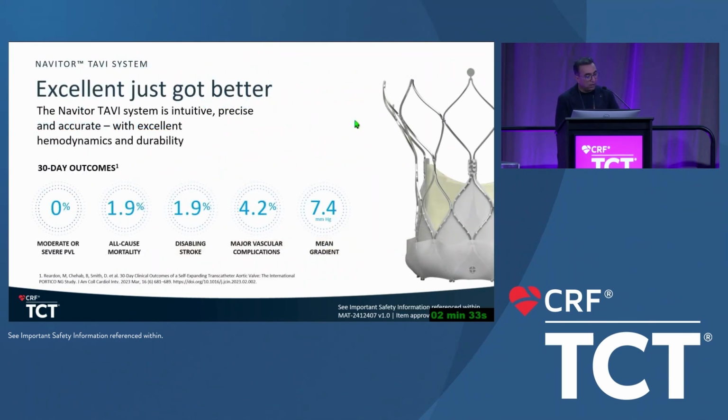And the data so far has been very reassuring. A lot of the people on this panel contributed to the data. As you see, 0% moderate-severe PVL, low all-cause mortality, 1.9% disabling stroke, and 4.2% major vascular complications, and this was in higher risk patients.